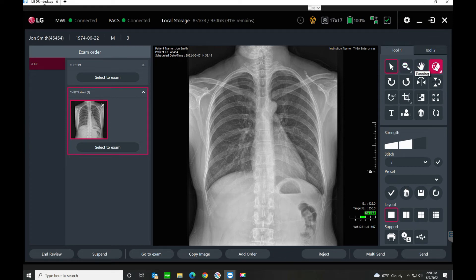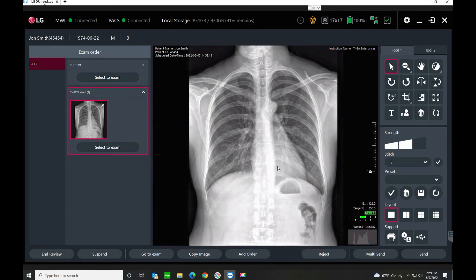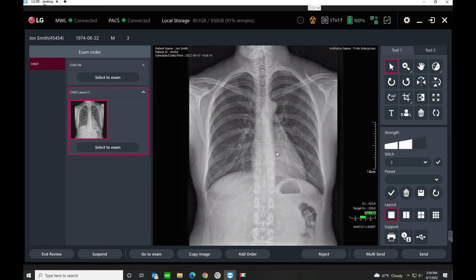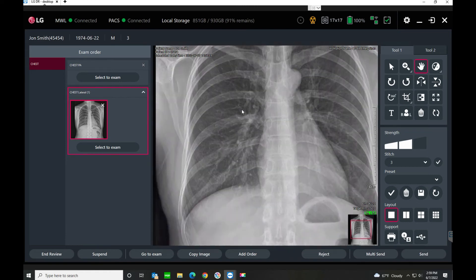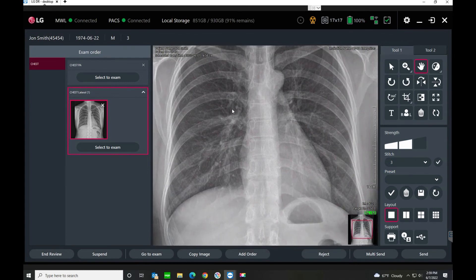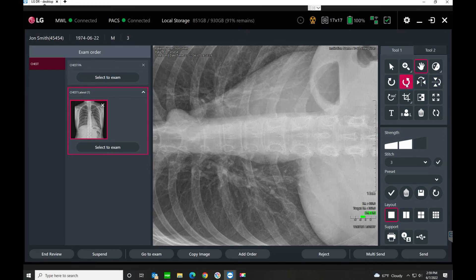There's a lot of different functionality in this viewer, and some of it is also on your mouse. If you want to play with window level, panning, or zooming, you don't really need to touch the buttons — your right mouse click controls your window level. Go up and down, left and right, and you'll see the brightness and contrast change. Roll the mouse wheel to zoom into the image, and click the left mouse button to pan around inside that zoom. You can also do flipping and rotating — you can turn the image every which way.